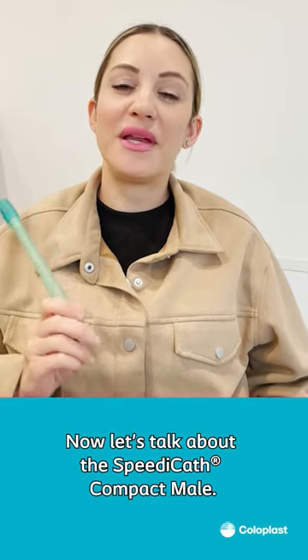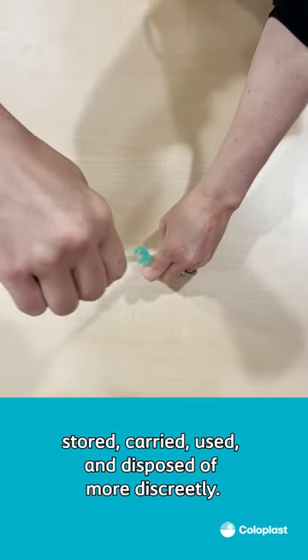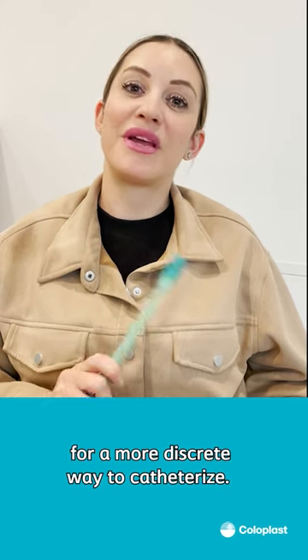Now let's talk about SpeedyCath Compact Male. The catheter's design allows it to be stored, carried, used, and disposed of more discreetly. This might be a great choice if you're looking for a more discreet way to catheterize.